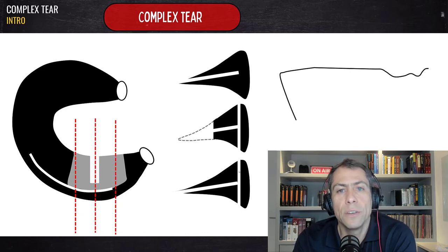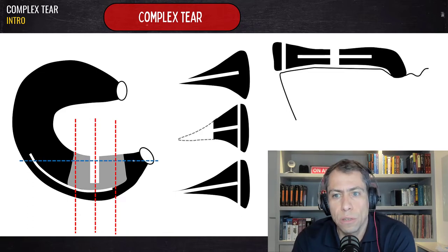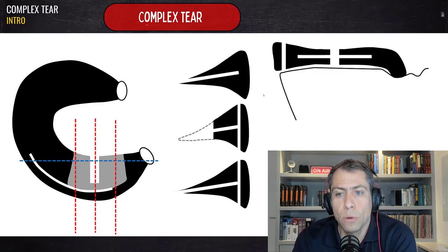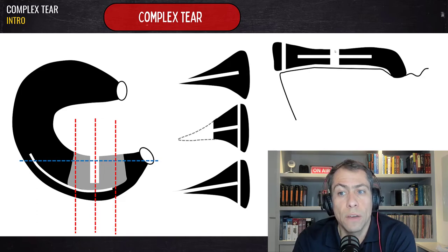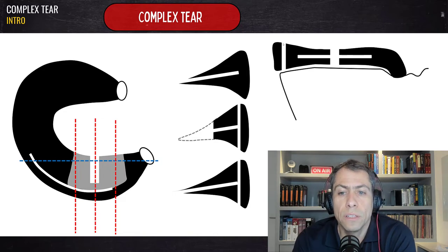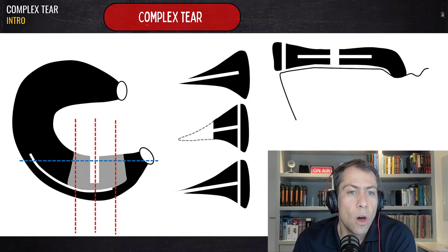In the meniscal long axis — in this case the coronal plane — we can also see the different patterns of meniscal tears. This horizontal line accounts for the horizontal tear. This other image is the partial cleft sign of the partial radial tear. And this other image at the periphery of the meniscus accounts for the vertical longitudinal component of this complex tear.